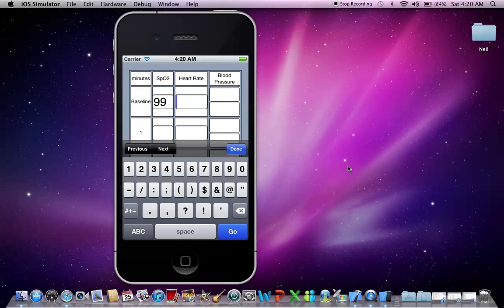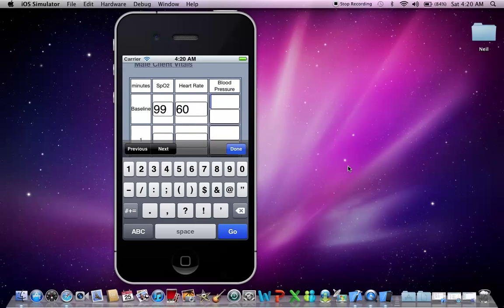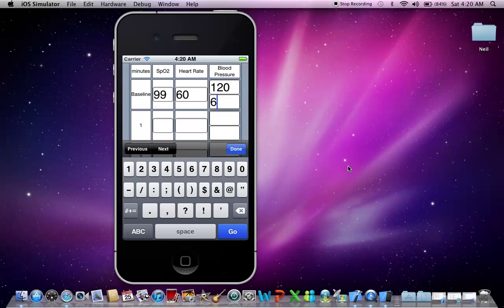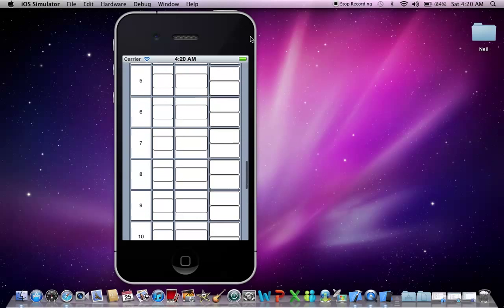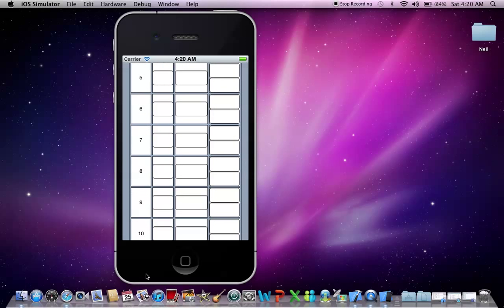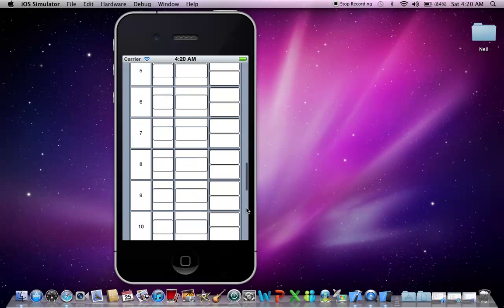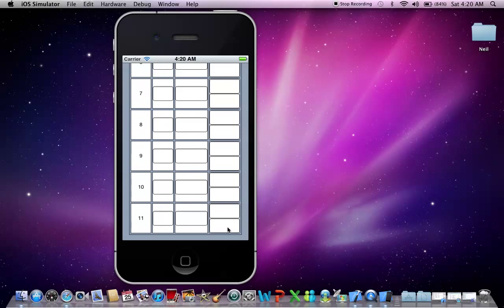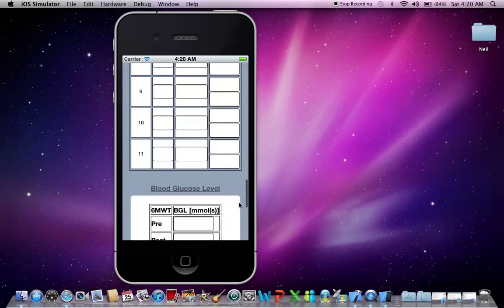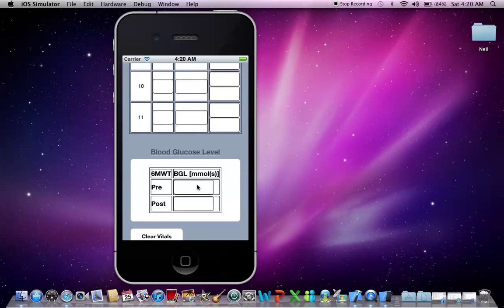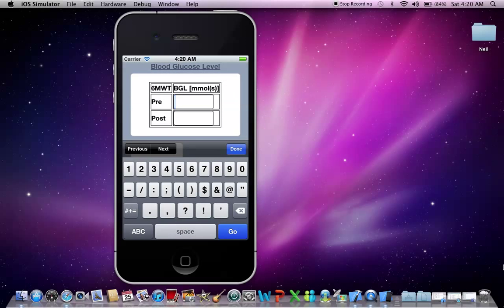So for example, I'm going to put in these values as my baseline observations. I'm going to scroll down to the blood glucose table and put in a pre blood glucose level.